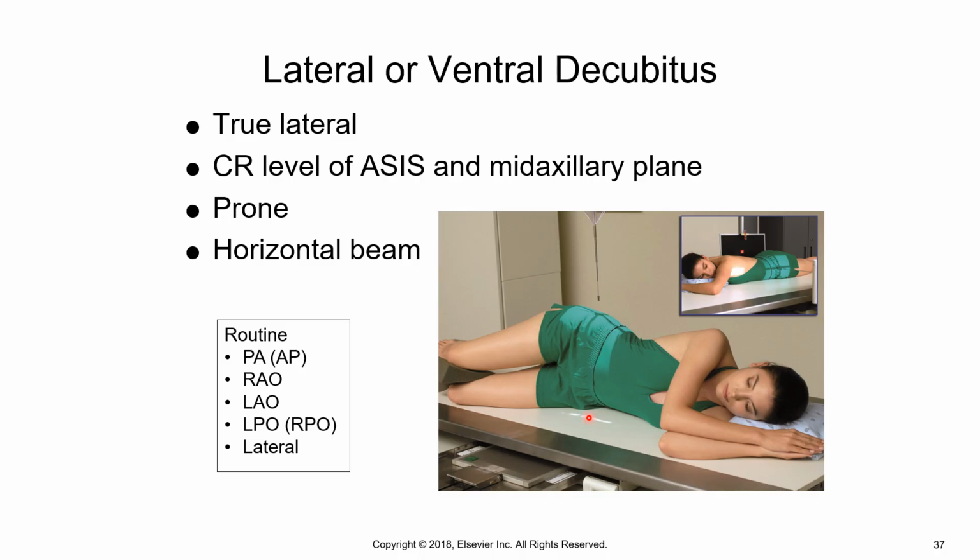Okay, so I'm not trying to be funny, it doesn't matter how big their backside is, the rectum is not going to change from being midline even if they have a big backside, because that is not bone structure typically on their backside. So you're at ASIS and midline.